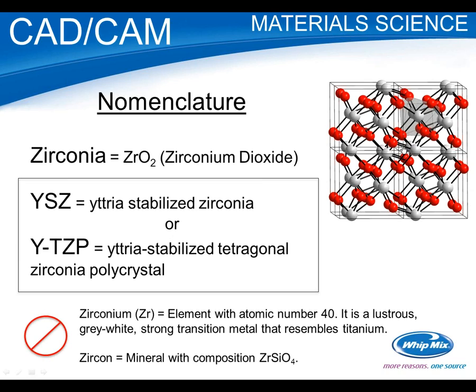I want to point out that porcelain, which you're primarily familiar with, is really different. Though they're both technically ceramics, porcelain starts as crystalline minerals, and when it's heated, it basically melts and fuses into an amorphous, glassy substance. So porcelain is closer to glass. Zirconia is not. Zirconia stays as a crystalline mineral. I point this out because with zirconia, we're not going up to a melting point where it goes from solid to a liquidy state, to fused. It's going to stay like this through its whole heating, sintering process. So it really is different than porcelain. Later when we talk about how we have to treat it differently, hopefully this will help, and that'll make more sense.